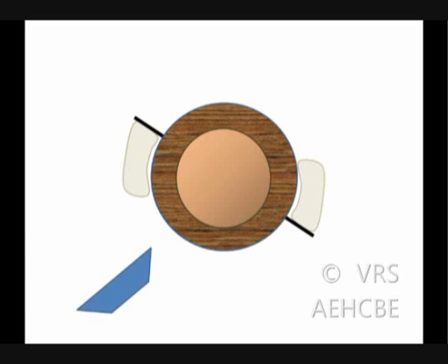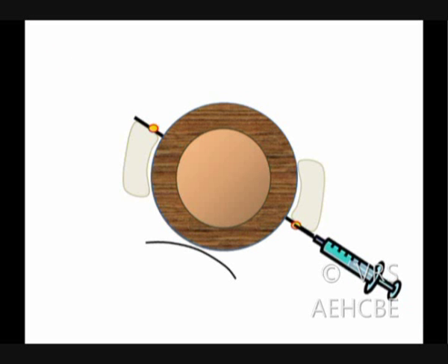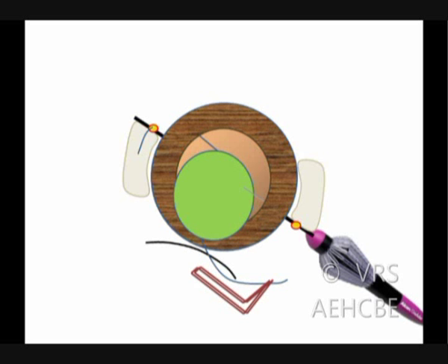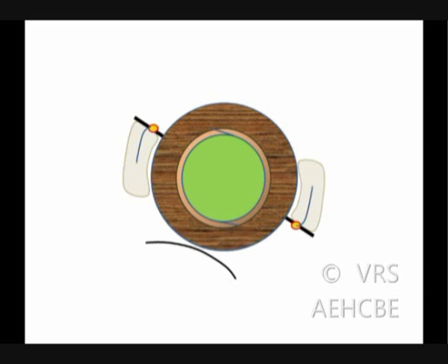A superior scleral tunnel is used for inserting the IOL into the anterior chamber. Using a 24 gauge intramuscular needle, the entry into the vitreous cavity is made approximately 1 to 1.5 mm from the limbus at the radial cut which was made earlier. Either a foldable or a rigid IOL is inserted through a superior corneal tunnel. Using either a 23 gauge or 25 gauge Max Grip Alcon forceps, the haptics are held and externalized out of the eye using these MIVS forceps.